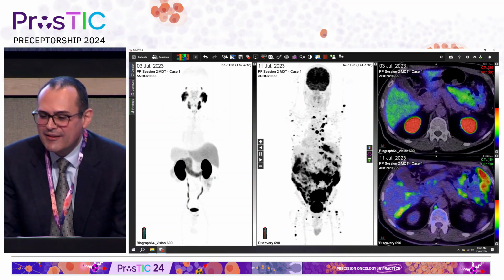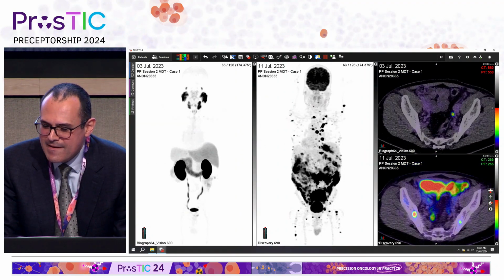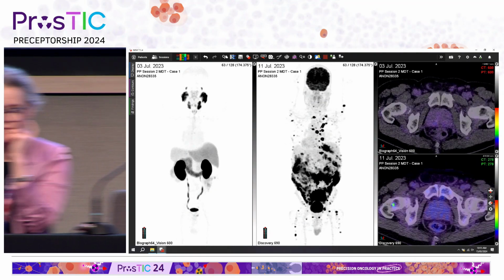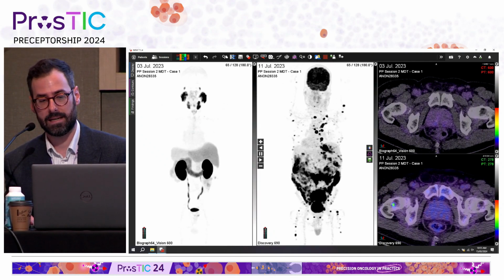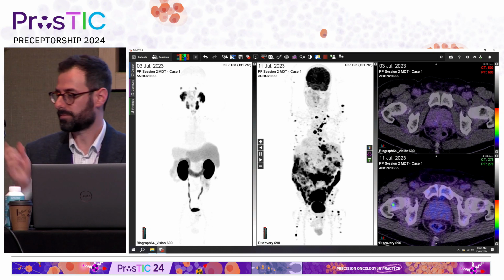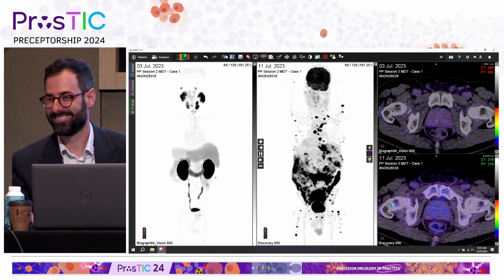Yeah, so maybe if we can have a look at the pelvis. Yeah, there's some spots. James, what did the biopsy show? Yes, the biopsy revealed, actually we withheld that he had CLL, so he was known for CLL, and he did have high-grade transformation. So it was unrelated. Great. Clinical information. Yeah, we might switch back to the other laptop.